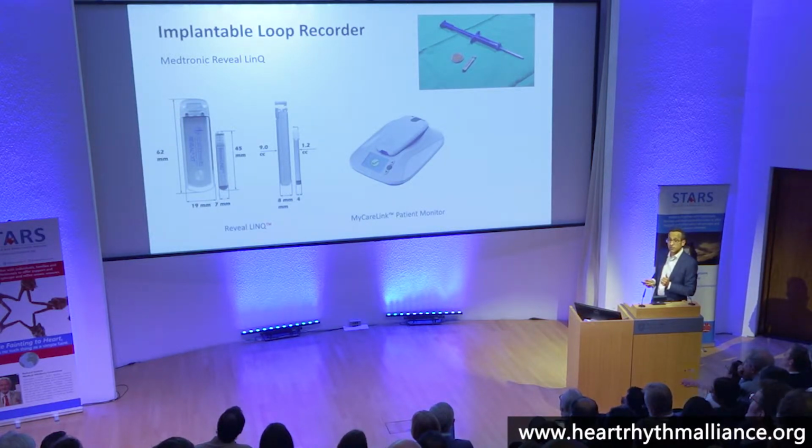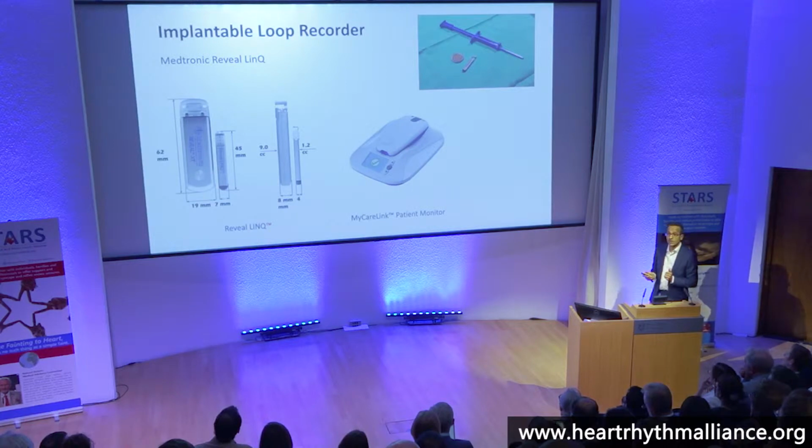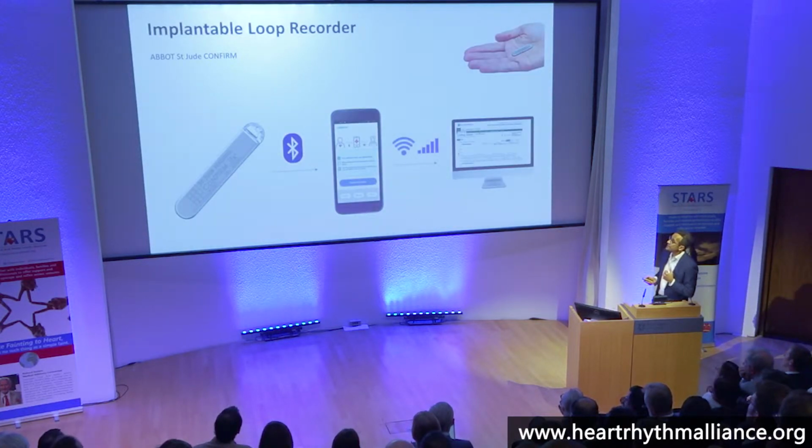There's a battery life of approximately 3 years, and it is now set up so that there's a home monitoring kit. Patients don't actually need to come in to the hospital for follow-up. They just need to park this by their bedside, plug it in, and it will automatically transmit data that's been downloaded and stored. This little component, which sits on top of the base unit, is a handheld device, so if the patient has any symptoms, they can simply hold it over the device, press the button, and log it.